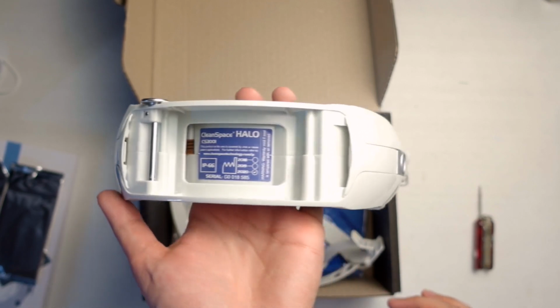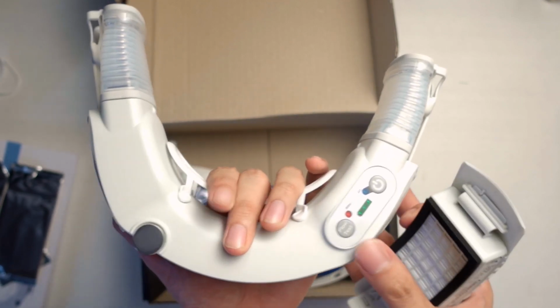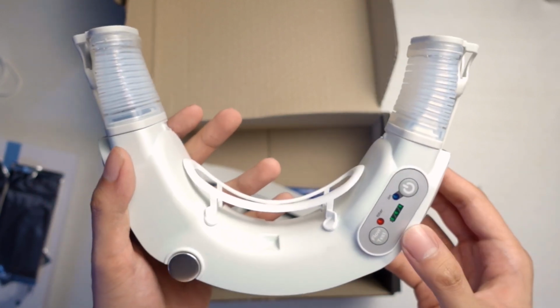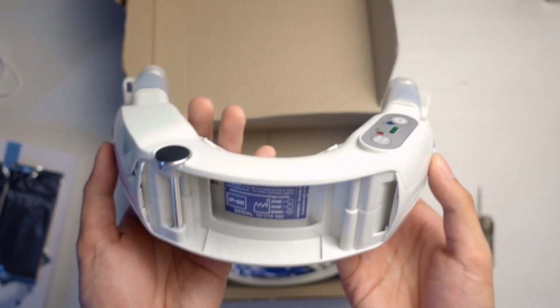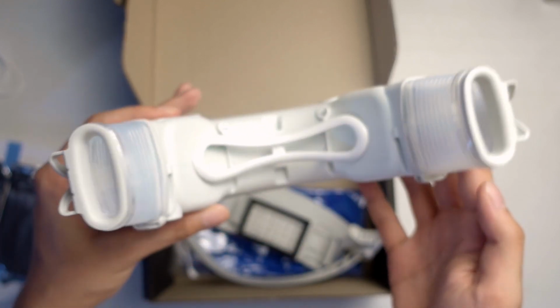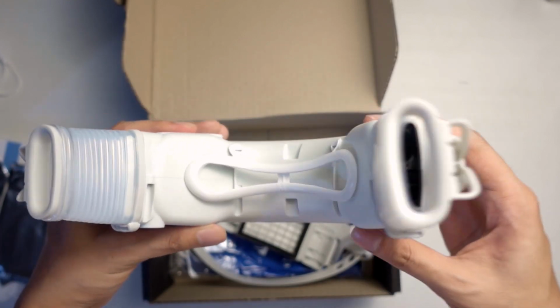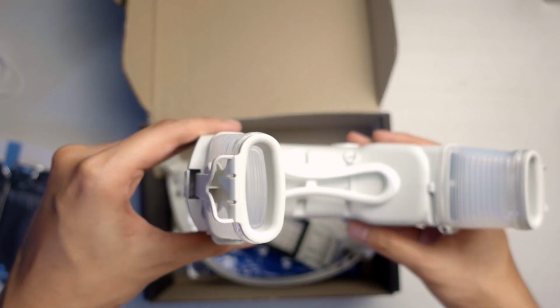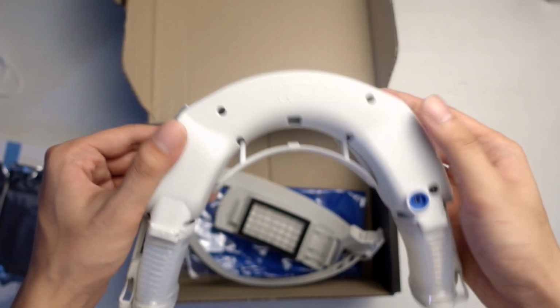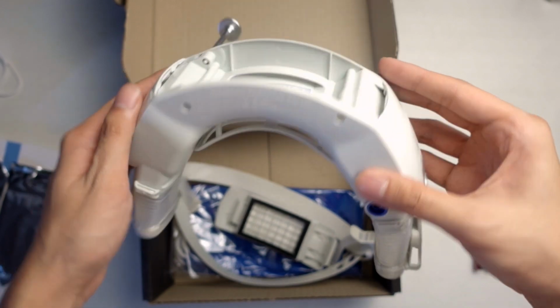Now we move on to the main blower unit. This is the back portion where the filter goes in, and this is the top portion where the controls are on the right side, and on the bottom left you see the lock for your filter. On the front, you have the smaller neck support already attached, and on both sides you have the air bellows. And on the bottom of the unit, you can see the charging port.